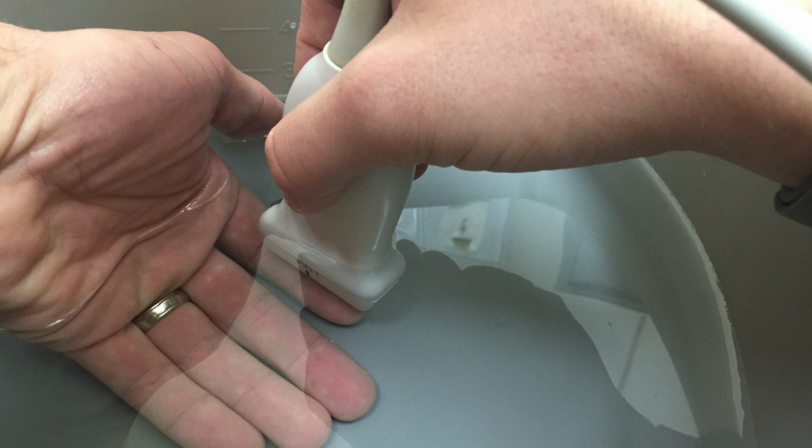And then in this situation, depending on your depth of water, you may not even need to make physical contact with the patient's finger here, because the water serves as its own standoff pad. So a couple different techniques that can be helpful as you work on trying to make the patient as comfortable as possible while you're doing your scan, right?